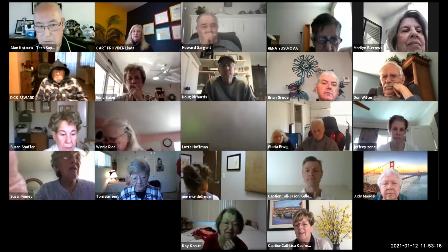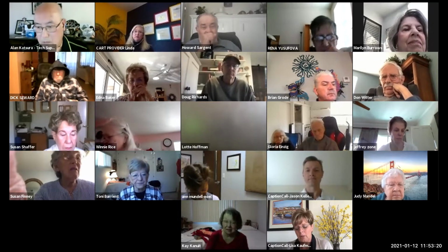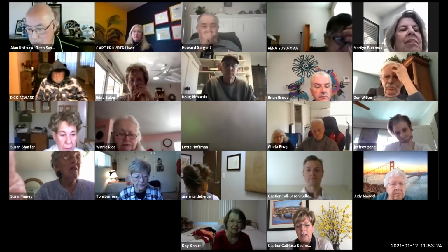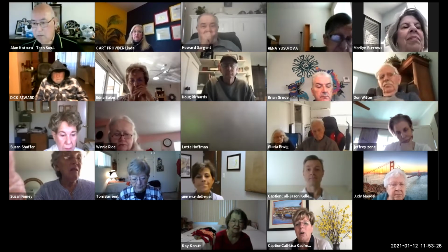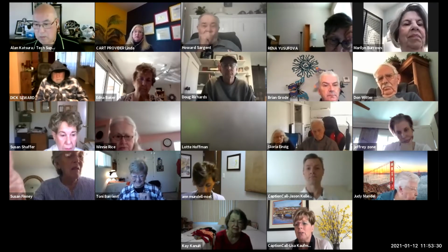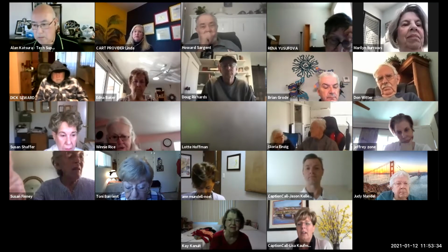Thank you, Tony. If there aren't any other questions, we can do the poll. I just want to be clear. You do not need internet in order to have a CaptionCall phone. You do not need a home phone line in order to have a CaptionCall phone. We have solutions. I have the poll questions.